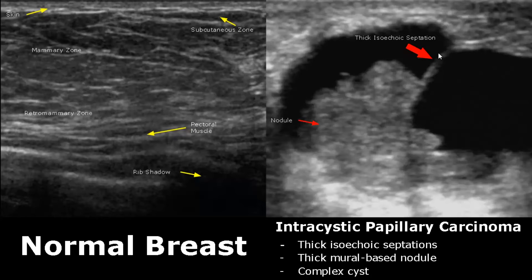This image has a thick isoechoic septation as well. These thick isoechoic septations are usually a sign of malignancy, as opposed to thin hyperechoic septations which are usually benign. Here is a large thick mural nodule.